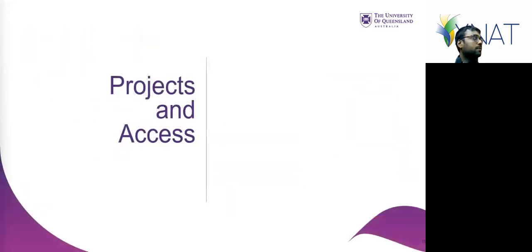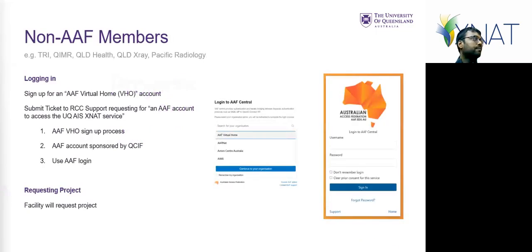Before you go on, is there a reason why you can't? You can actually access your UQ RDM using other methods. You can set up either a private personal account, or you can use EduGain, or you can use LinkedIn. Why is that not possible with the XNAT?